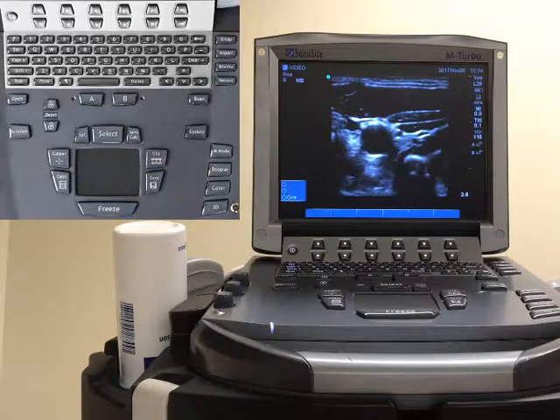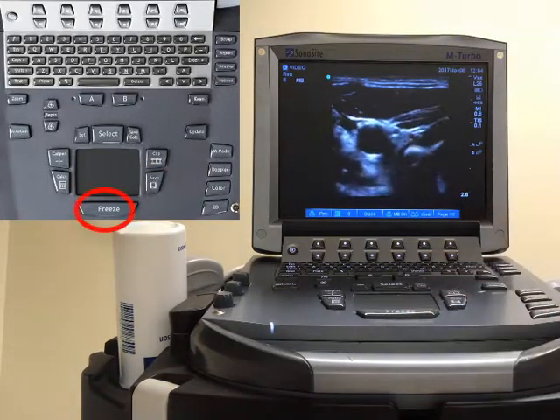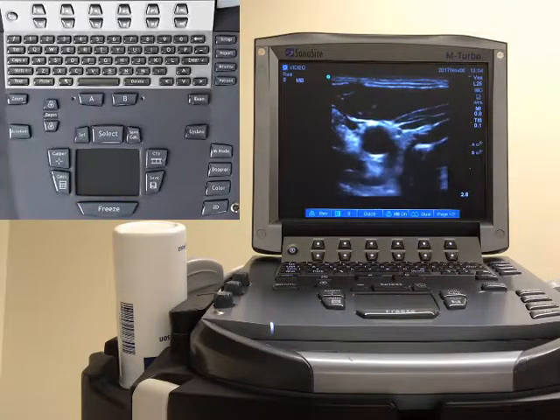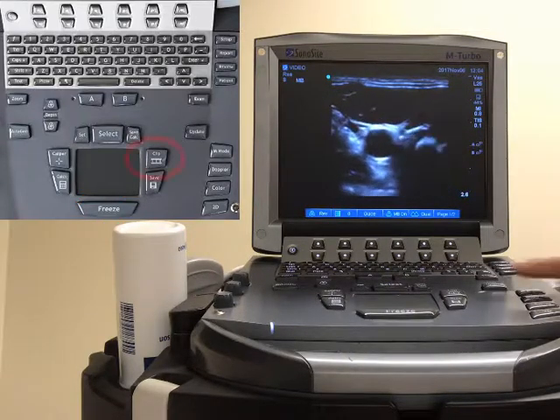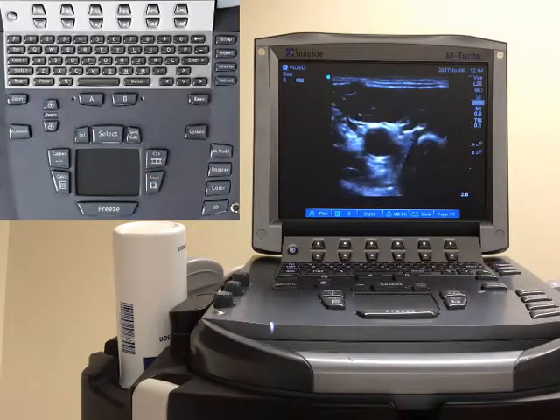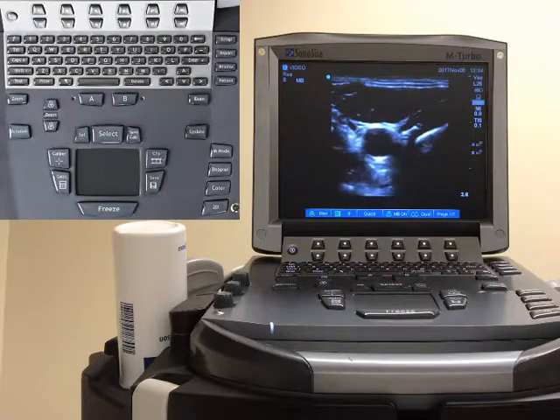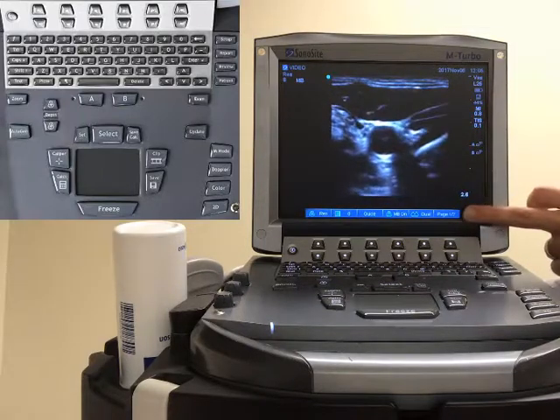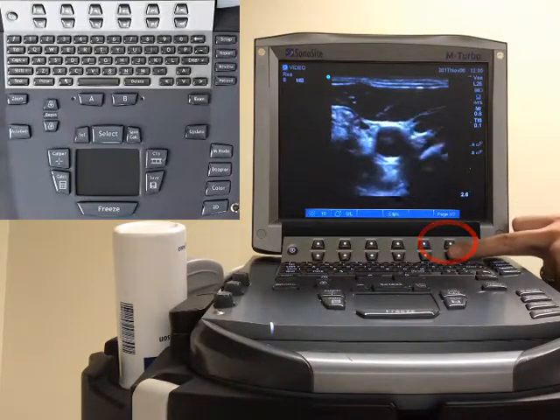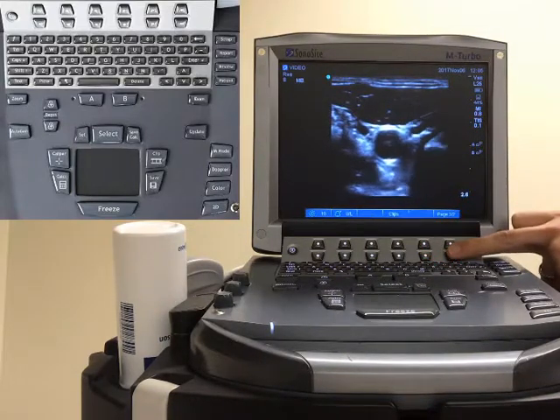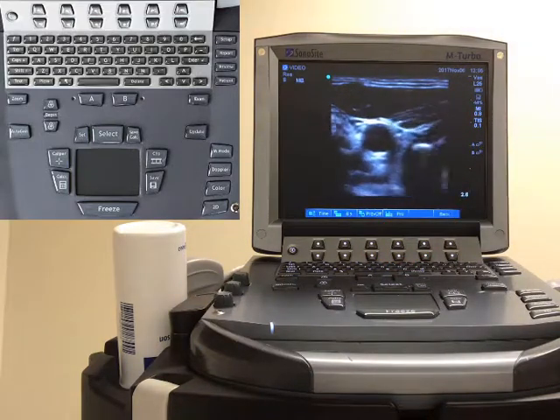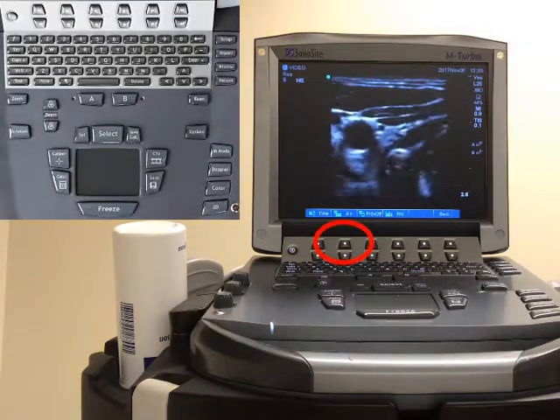Press freeze to unfreeze. If you wish to take a video, push the clip button and it will take a video clip. The duration of the clip is decided based on the lower screen. If you use the soft keys to go to page 2, there is a clips button, and when you push clips you can see in the second box that the default length is 6 seconds.